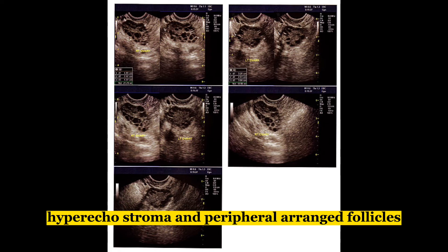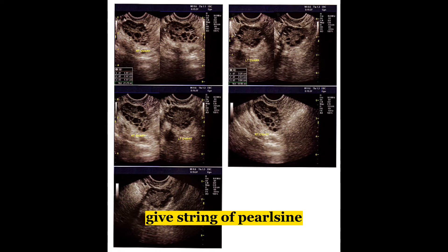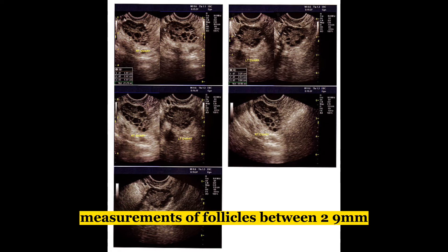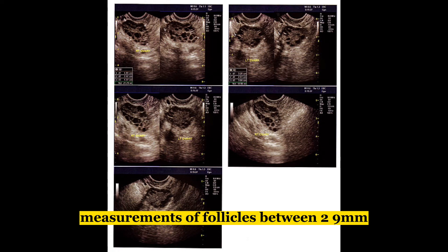Hyperechoic stroma and peripherally arranged follicles give the string of pearl sign. Follicle measurements are between 2 to 9 millimeters.